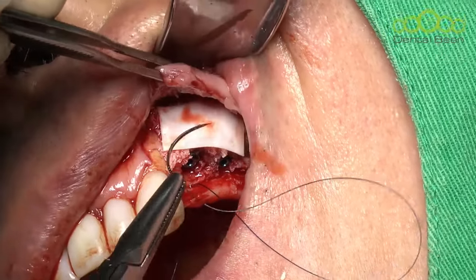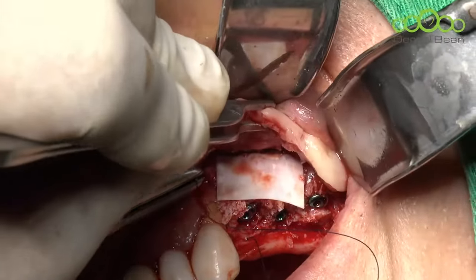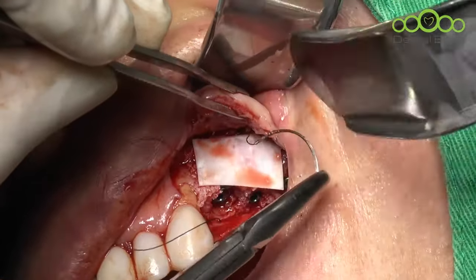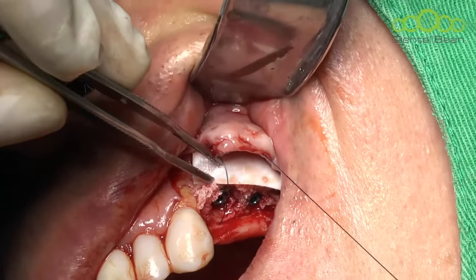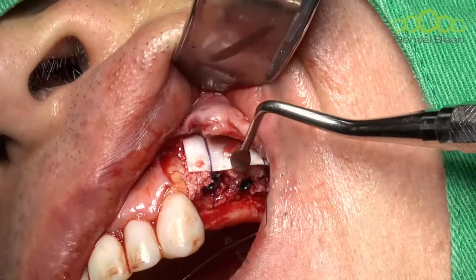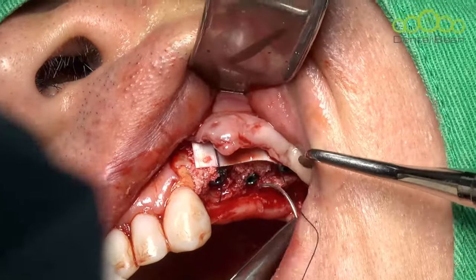Okay, from Hong Kong, one dentist asked me what kind of membrane I use, and when I should remove the stitches. Well, I'm using collagen membrane. It's common collagen membrane. It is not BioGide, it is BioCover from one Korean company.